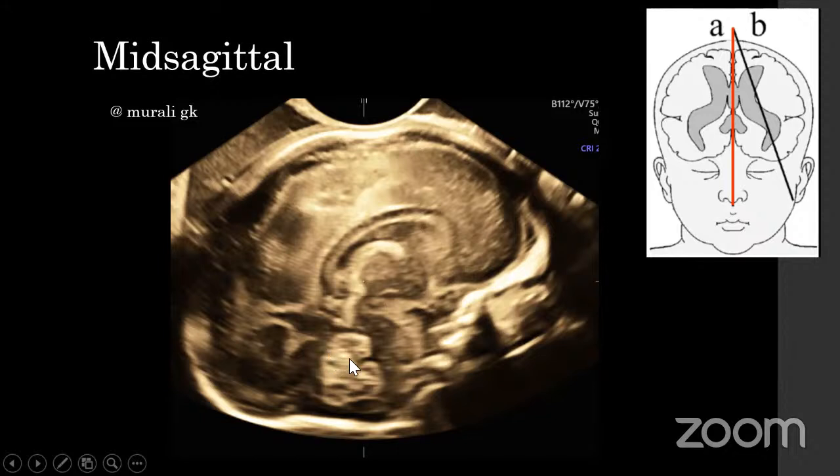This is the indentation which divides the vermis into the upper 1/3, the superior lobe, and the lower 2/3, the inferior lobe. When you can appreciate the primary fissure, the indentation, the fastigium, and the division into two lobes, you are rest assured that this cerebellum looks normal. If you are still in doubt, you can go ahead and do a biometry. You can take craniocaudal and anteroposterior measurements. There are nomograms you can check to rule out vermian problems.